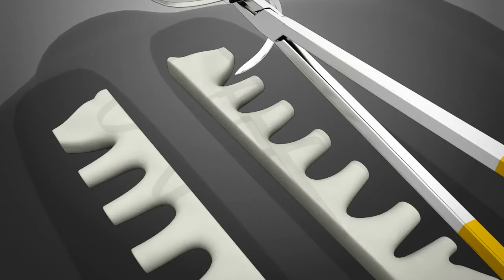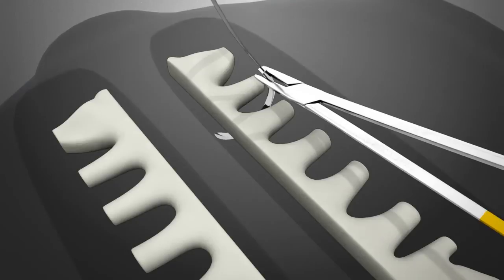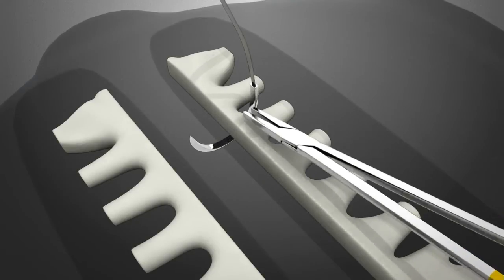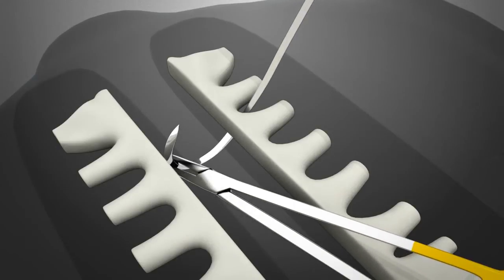The Figure 8 strap is applied to the sternum in much the same way as standard steel wire. The needle may be delivered in a transsternal or parasternal fashion into the far sternal half. Be careful not to twist the strap as it passes through the tissue.